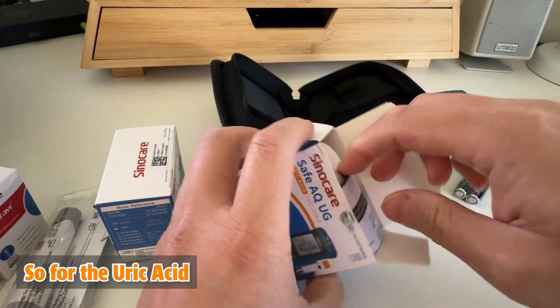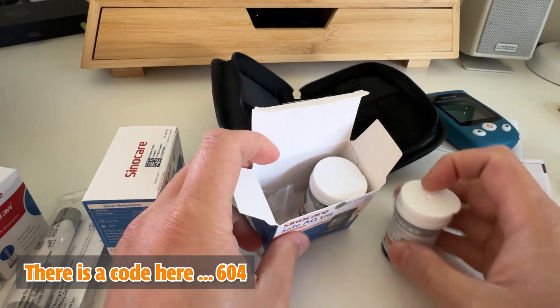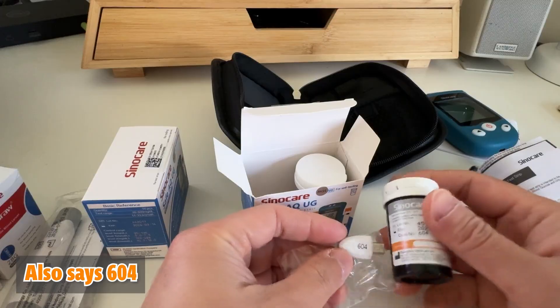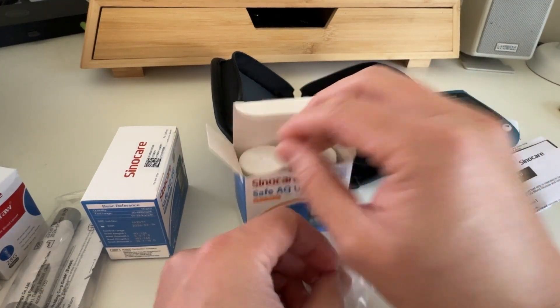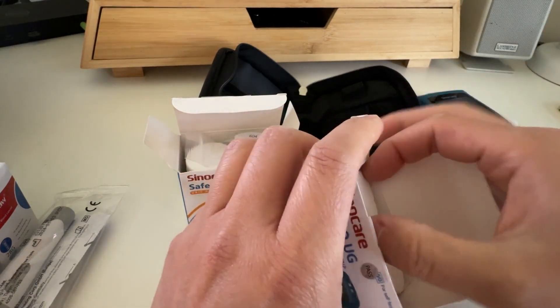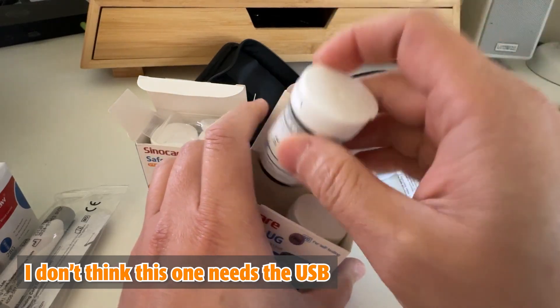For the uric acid strips, there is a code here: 604. And the USB also says 604 — it's matching with code number 604. With the blood glucose testing strip, it doesn't say anything about a code; I don't think this one needs a USB.